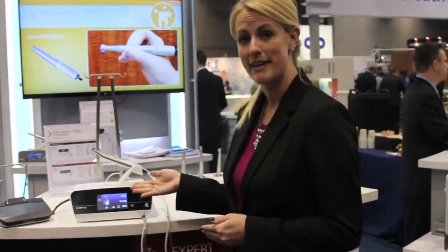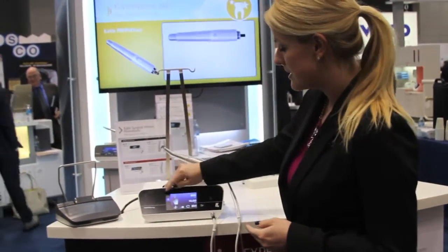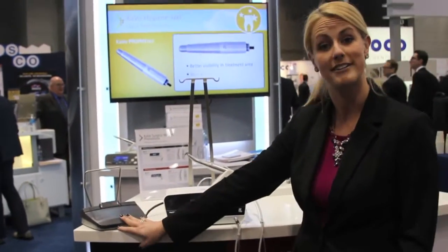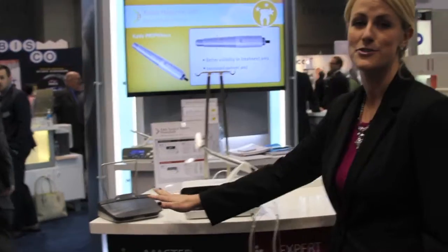It has a nice color display and this one is actually a touch screen. So you can scroll through your programming steps super easily on the screen or on our wireless foot control.